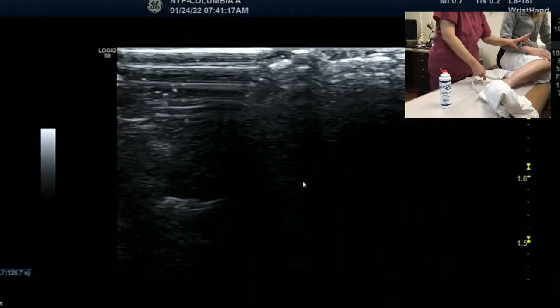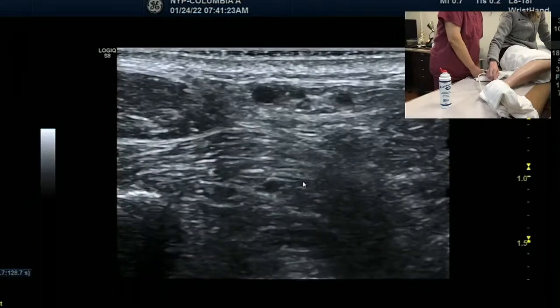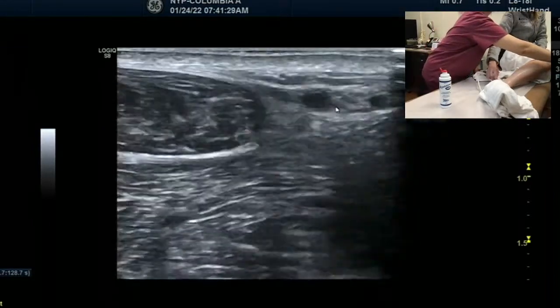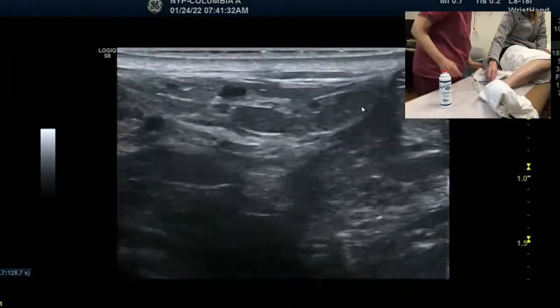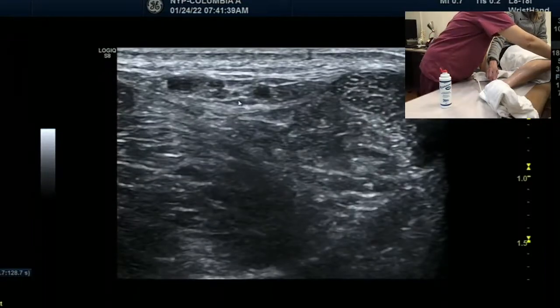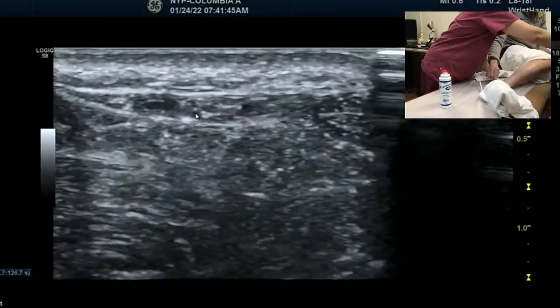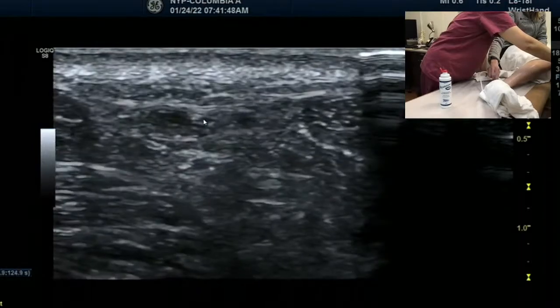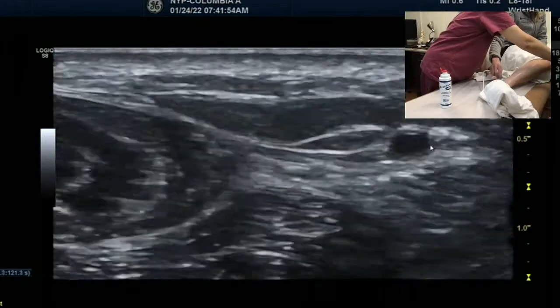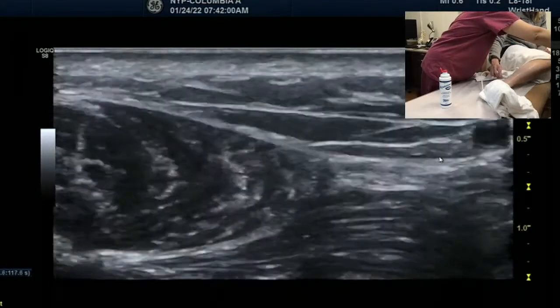And then you scan up. Here, okay, so we see it very nicely. I'll follow. If you go up, it's very slippery, right? Okay, so we see it nicely there. And it's going more superficially. It's going up. Are you scanning up? As she scans up, it's now going into adipose, very close to here. Show us. I'm going back down.